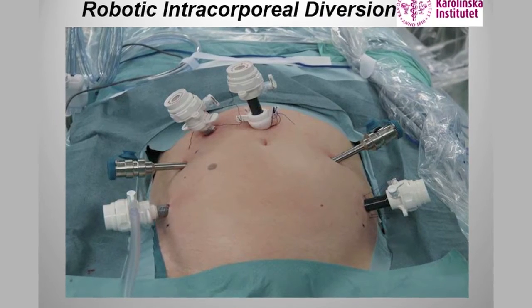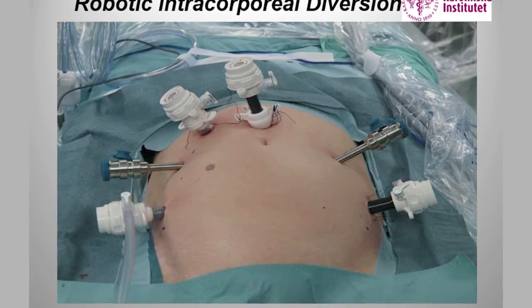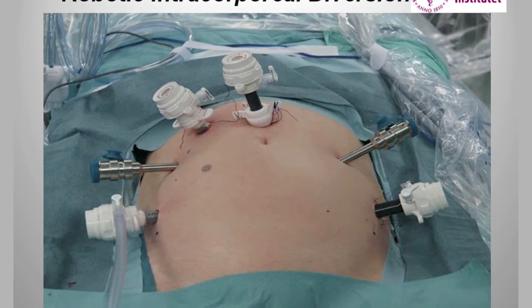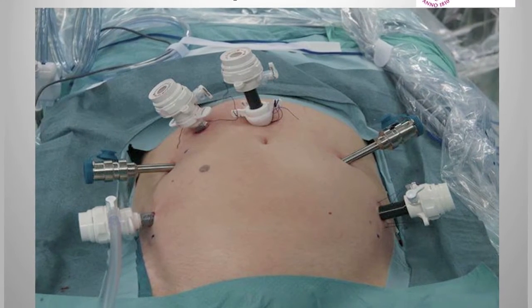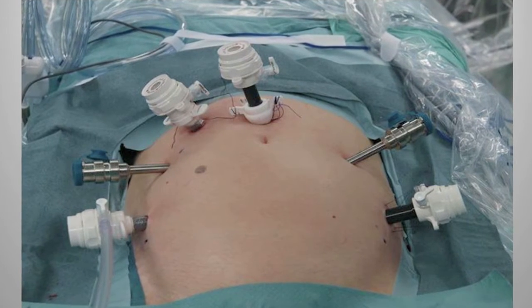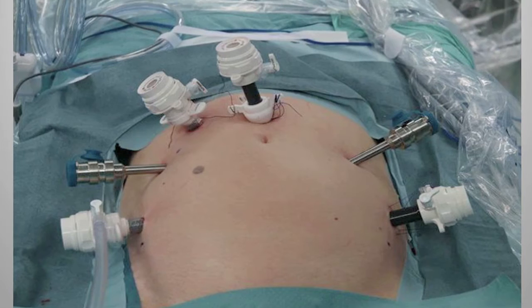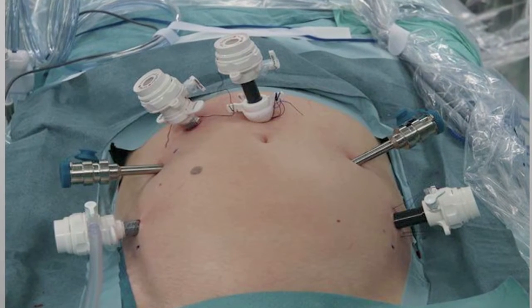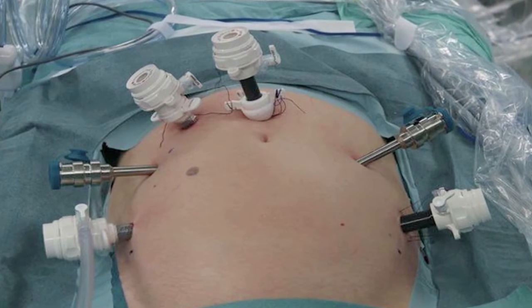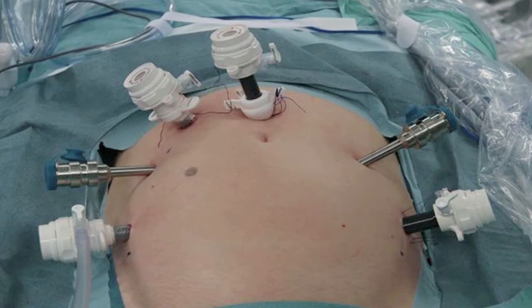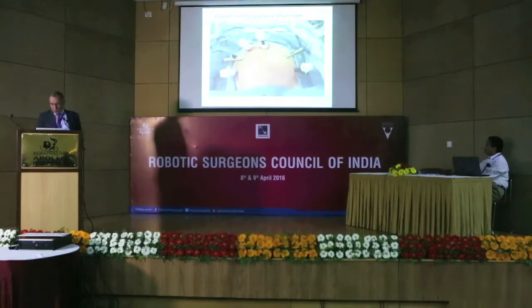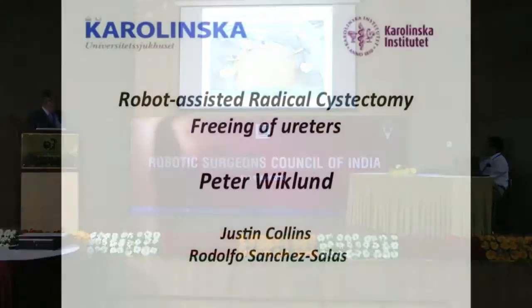When you do robotics, you will be a slave to your port placement. If you're not careful how you place your ports, you will struggle — especially for an operation like cystectomy and urinary diversion where you need to be in different areas of the abdomen. We start by placing ports relatively high up: the camera port is about five to six centimeters above the umbilicus, and all ports are high up. This allows you to work down in the pelvis and also in the right quadrant where much of the urinary diversion work is done.